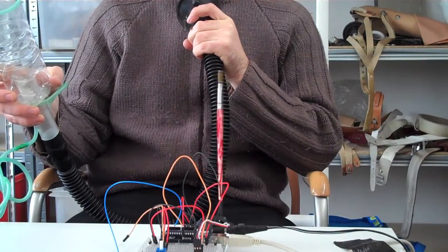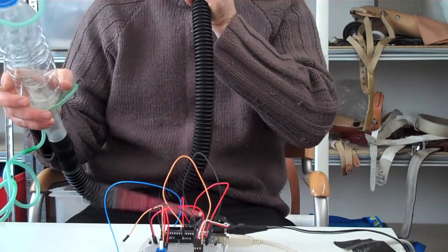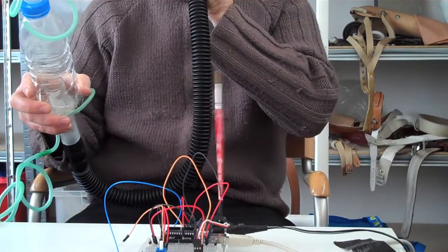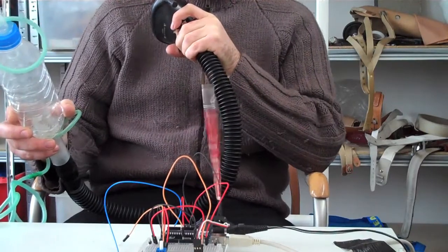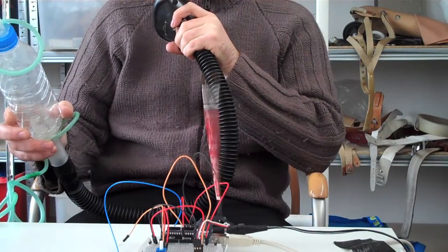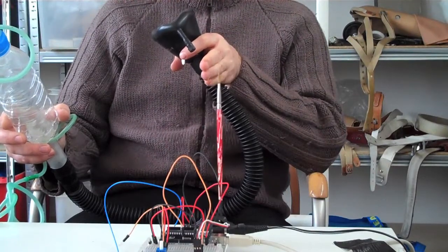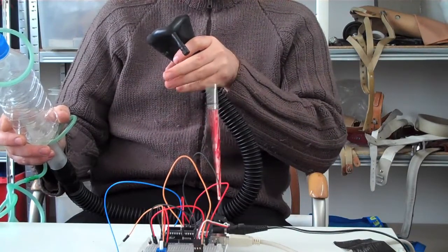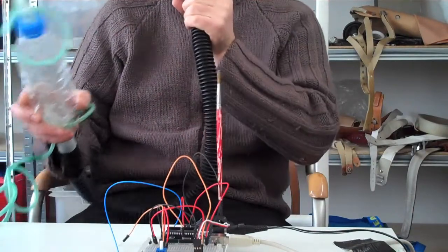Now I'm going to try to rapidly inhale and exhale. As you see, I'm not calibrated. I'm actually reaching the maximum range of the 1024 either way, but that illustrates what's going on. Obviously, if we integrated the volume flow rate, we would get actual volume flow over time, so we should be able to see the actual volume of air being inhaled and exhaled from my lungs.